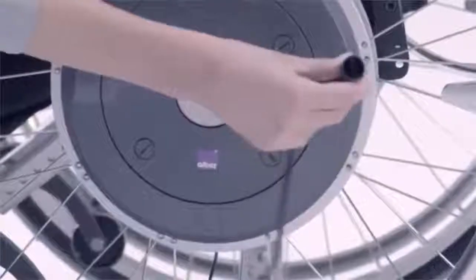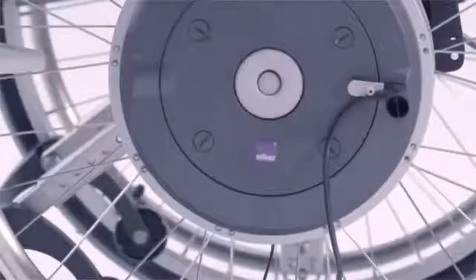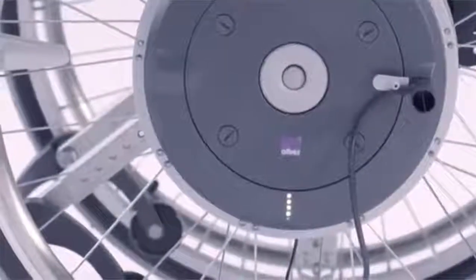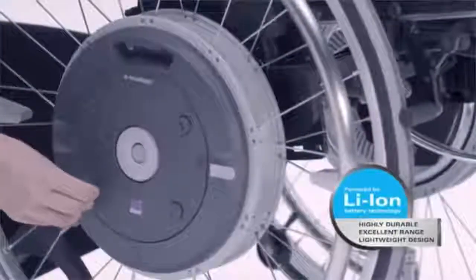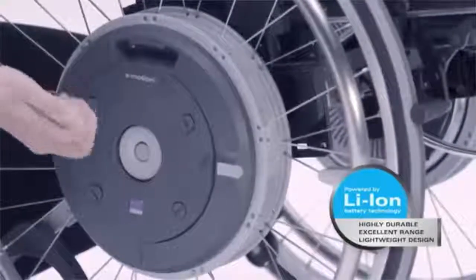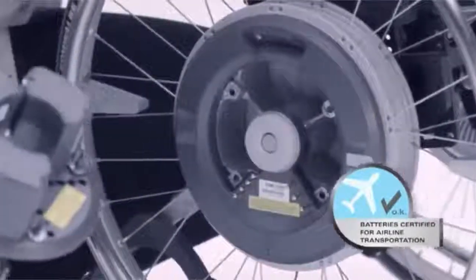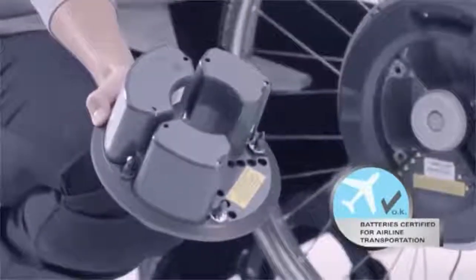The battery packs can easily be recharged using the battery charger. As soon as the pack is ready it switches off automatically. The lithium-ion batteries last for a very long time, are light and have a long service life. The batteries can be removed when the chair is serviced or when travelling by air.